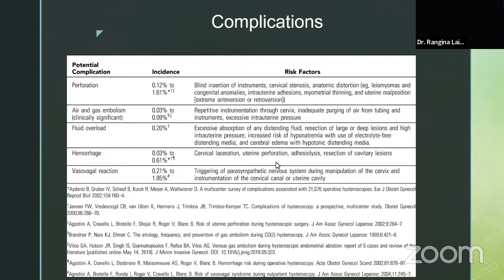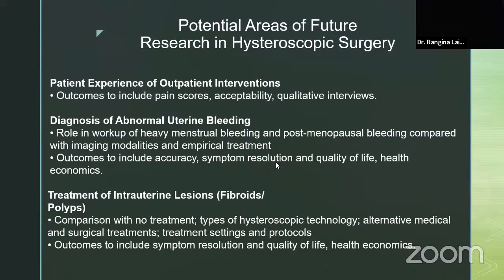Yes, about perforation, although it is a blind insertion of the instrument, we can see very clearly, and I think hardly any perforation happens these days. About fluid overload, it was more common when we used monopolar and isotonic fluids like mannitol. And about hemorrhage, I think it is also very uncommon nowadays.